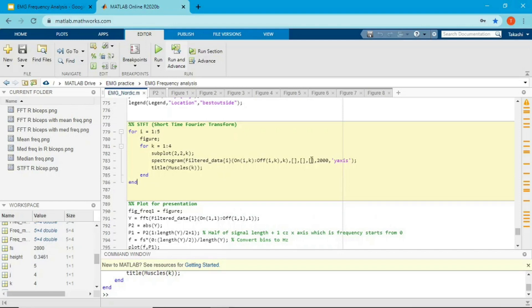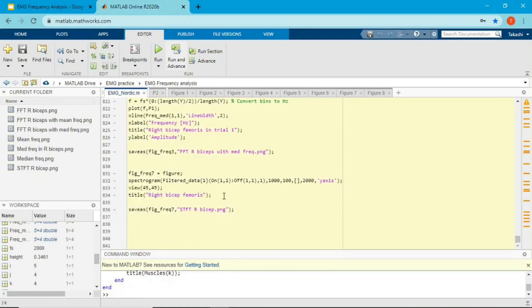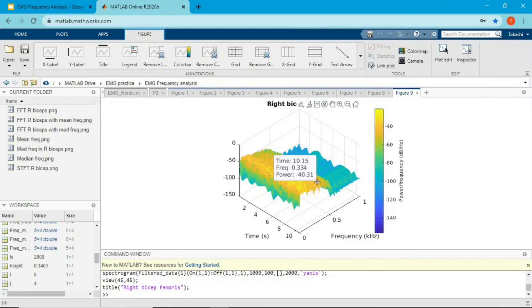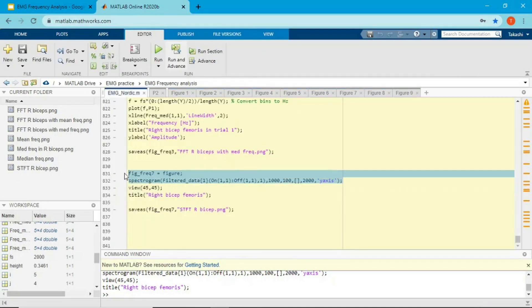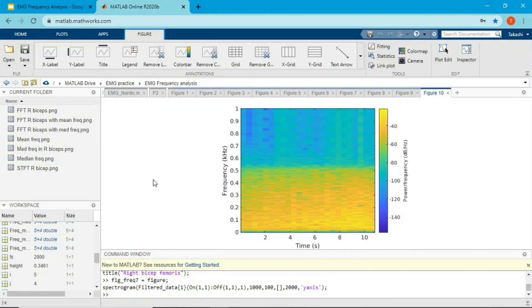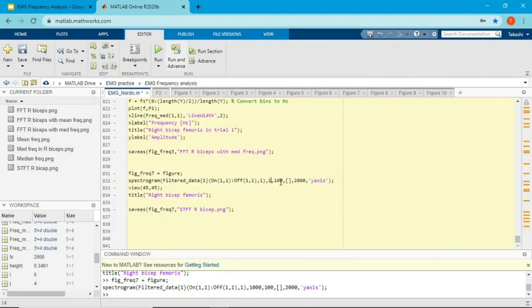There's no universal value for frequency resolution — you have to experiment. I'll put the code on my blog so you can play around with the numbers. Here I put 1000 for time window, 100 data point overlap, default frequency resolution, 2000 sampling frequency, and yaxis. With these settings the resolution is quite fine, so I'll change the view using the view function to rotate the plot.